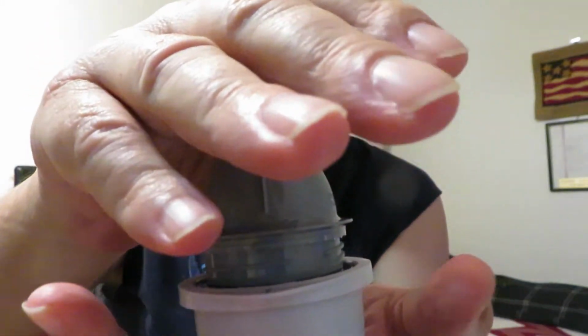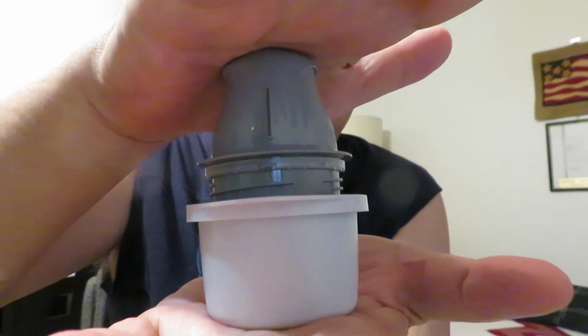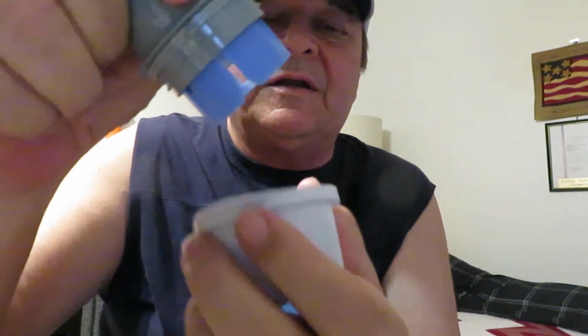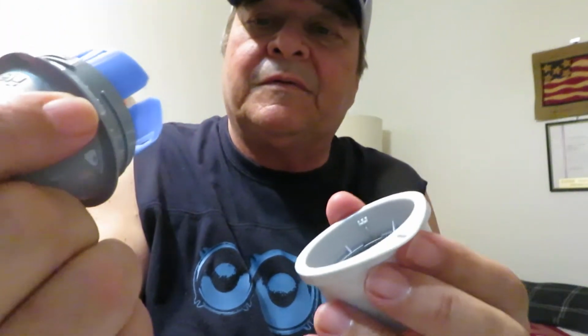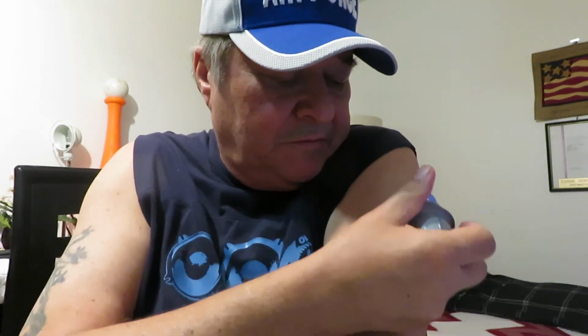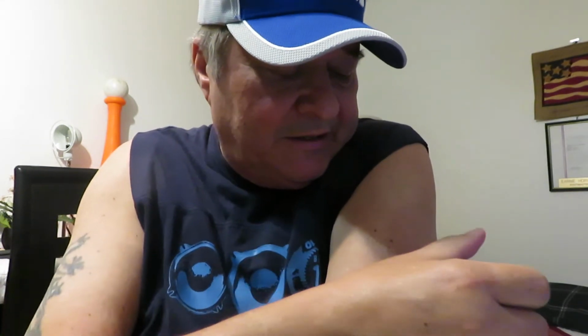And then you hold it, or you can use a hard surface. Push. That was simple. A lot easier. Pull it apart. Oh crap, you can see the needle in there now, but it doesn't matter. I know it doesn't hurt. Just don't look at it. Now I'm going to put it on the back of the arm again. The other one. Had it on this one the last time. So whatever's there healed up.